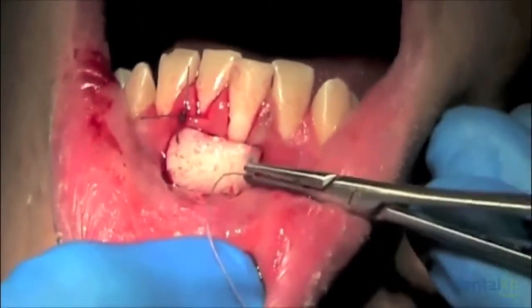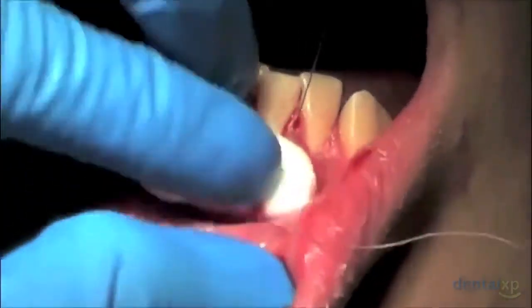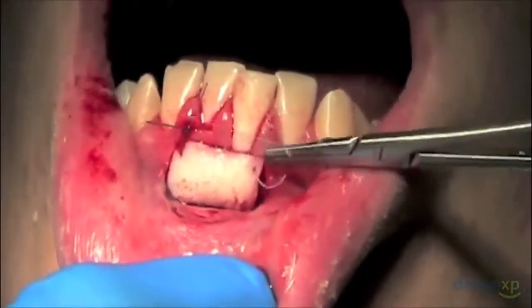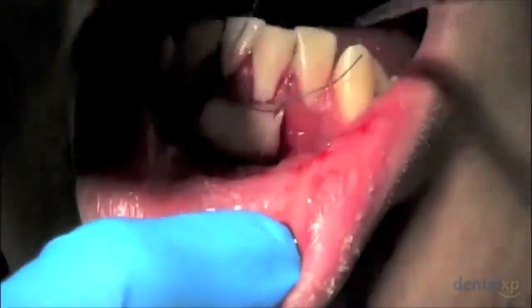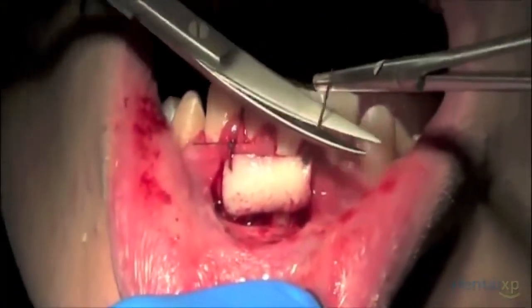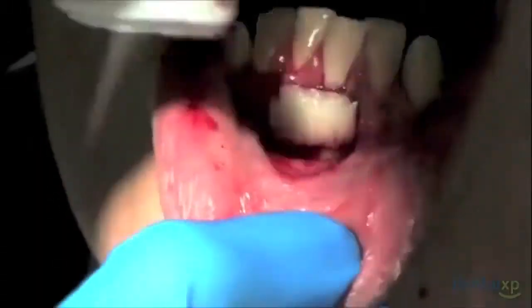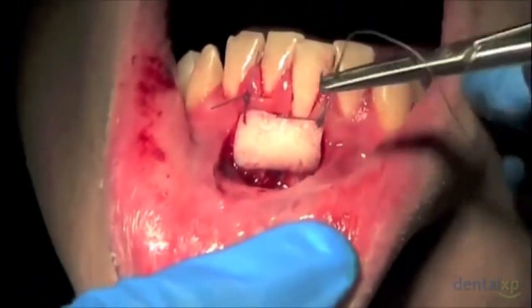I prefer not to suture the apical extent of the graft. Rather, I will leave that part of the wound open, and it will simply granulate in via secondary intention. I have found that this will properly eliminate the frenum pull that was present earlier. In addition to that benefit, I'll also want to point out that this does not add significantly to the patient's post-operative pain or discomfort. Most people still will report the majority of their discomfort being in the roof of the mouth versus the recipient site.